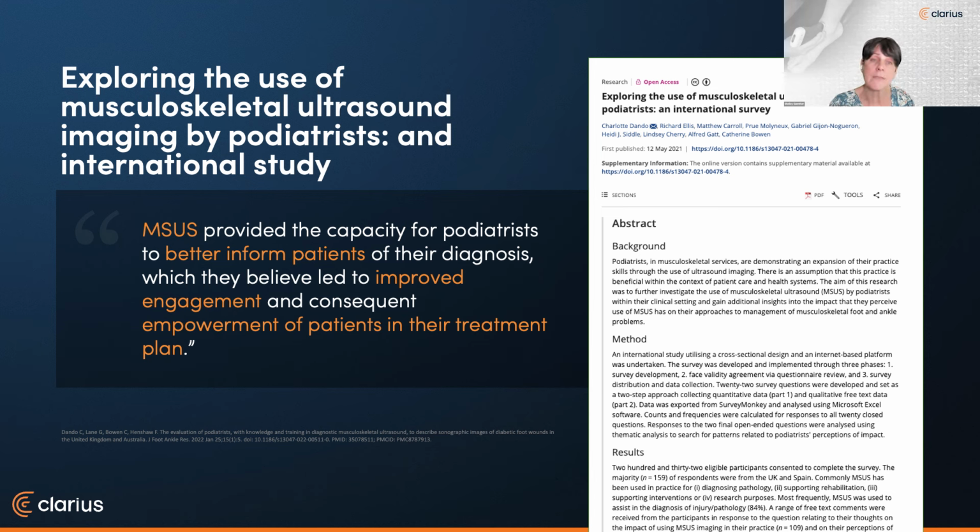This first paper is from the Journal of Foot and Ankle Research, and the aim was to further investigate the use of musculoskeletal ultrasound by podiatrists within their clinical setting and gain insights into the impact that they perceive the use of musculoskeletal ultrasound has on their approaches to management of MSK foot and ankle problems. The perceived benefit of the 232 podiatrists who participated was an improvement in the patient journeys through tighter focused management plans and reduced waiting times. An additional novel finding was that ultrasound provided the capacity for podiatrists to better inform patients of their diagnosis, which they believed led to improved engagement and consequent empowerment of patients in their treatment plans.